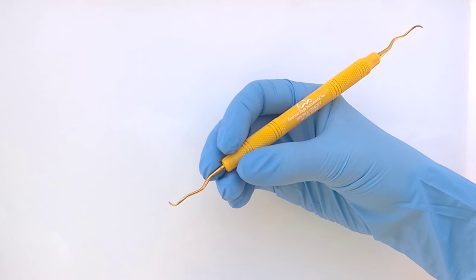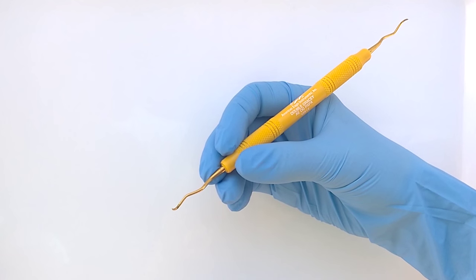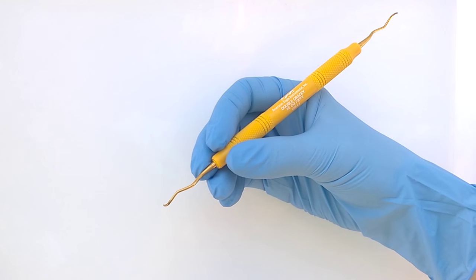I'm demonstrating the double Gracie from American Eagle Instruments. They have taken the two-set Gracie and made it into one instrument.